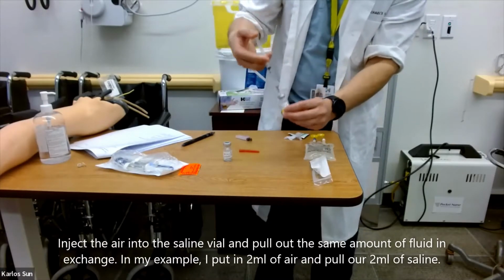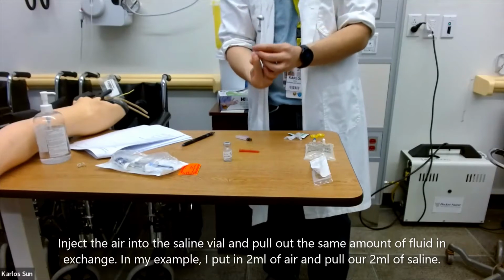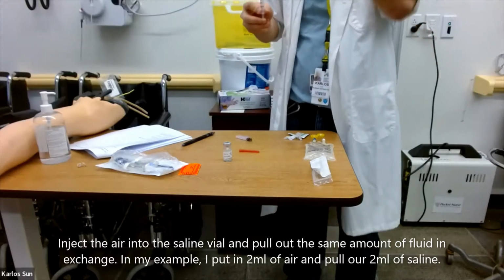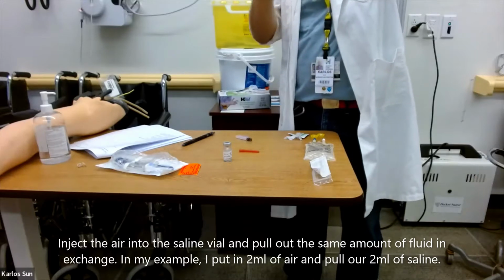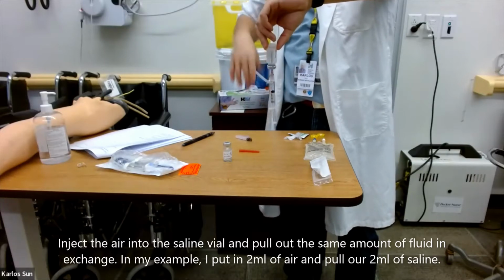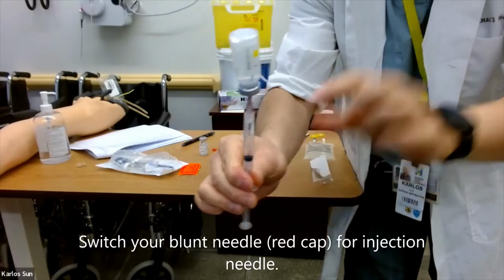Now inject the air into the saline vial and pull out the same amount of fluid in exchange. In our example, we put 2 milliliters of air in, therefore we're going to remove 2 milliliters of saline out. Now, if you have been using a blunt red needle, this is the time that you're going to switch it for an injection needle.